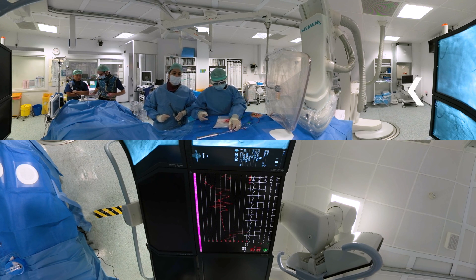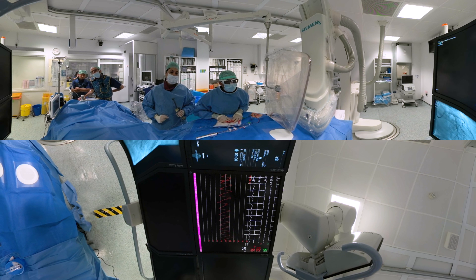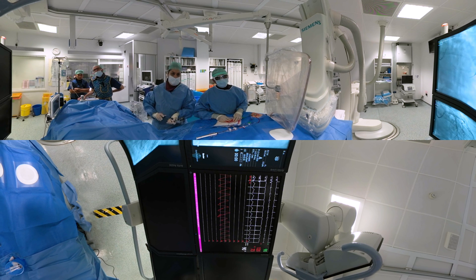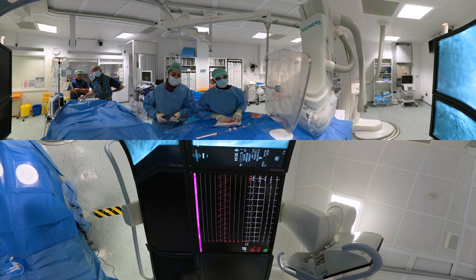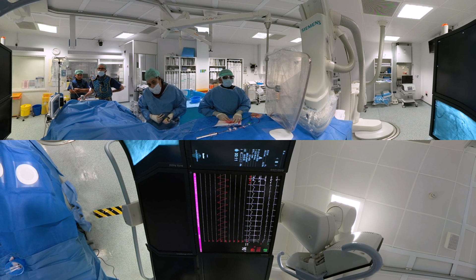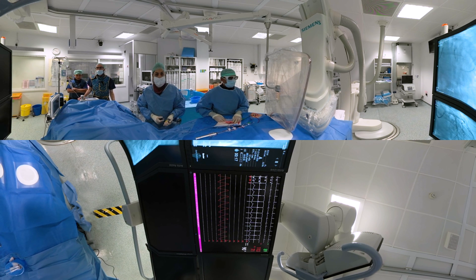The first thing we need to do is to get a wire through the blockage, then we stretch up that blockage with a balloon. I'm using the x-ray equipment just to see where the balloon is in the artery. Inflating — stretching this artery now with the balloon, up to twelve bar. You might get some discomfort while that's going on because the balloon temporarily blocks the blood flow — that would be quite normal.